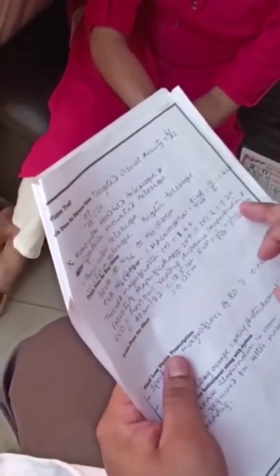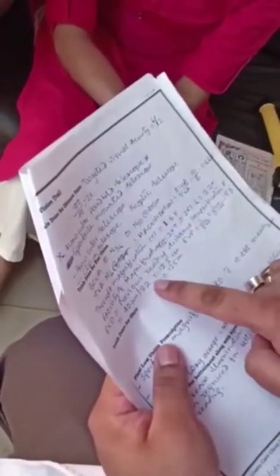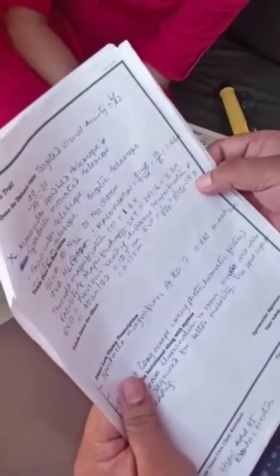Now to calculate at what distance the patient should read, basically EVD, or equivalent viewing distance, is the previous distance at which the patient was reading with magnification. So magnification we have made 3.2, and the patient was reading at 40 centimeter, we have already documented. So 40 by 3.2, in meter we can calculate, is 0.125. Now we should calculate the magnification we need for the patient. For her EVD we got 0.125. So the dioptric power will be 1 meter by 0.125, that is 8 diopter.